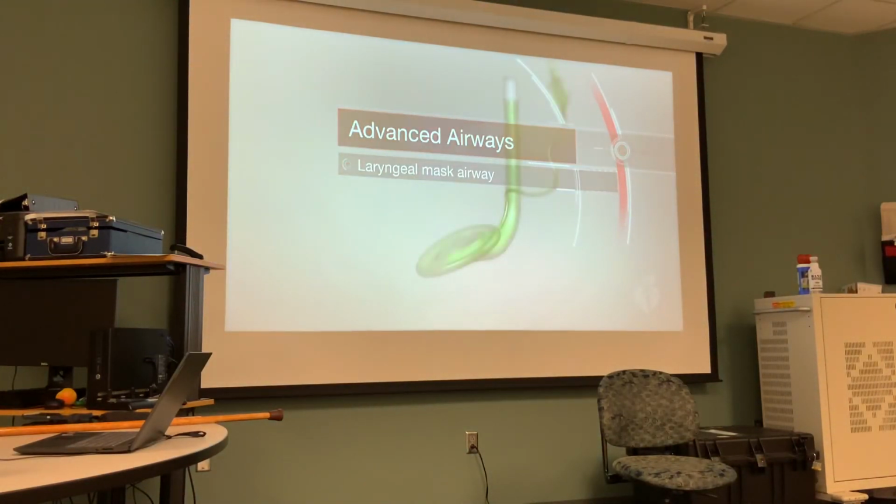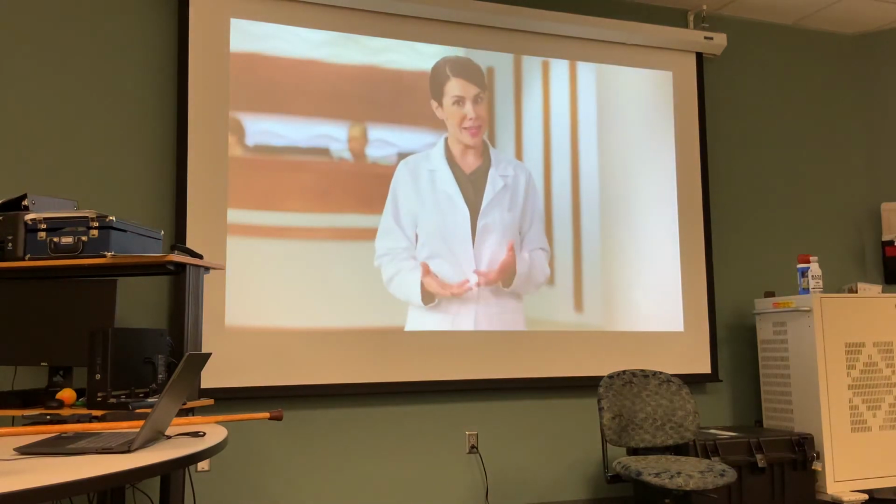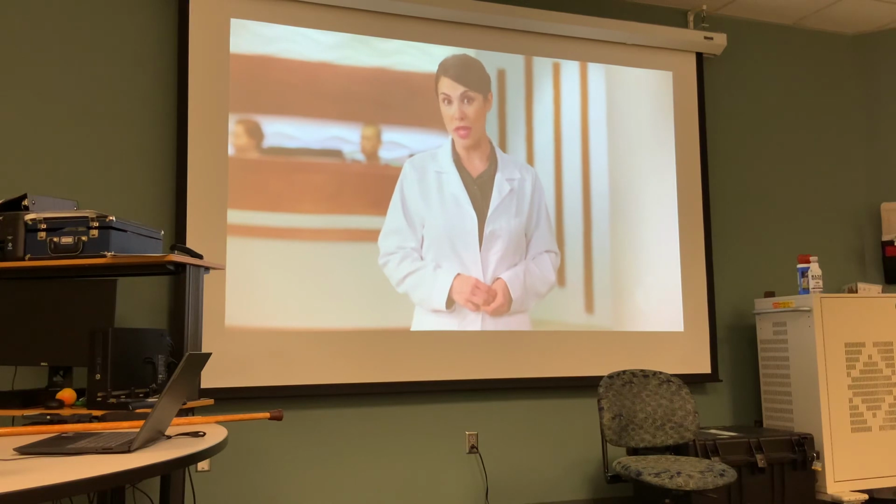The laryngeal mask airway is a supraglottic airway device that healthcare providers can insert without visualizing the glottis. In addition, it can be inserted during CPR while chest compressions continue uninterrupted. This makes training easier and insertion more reliable.